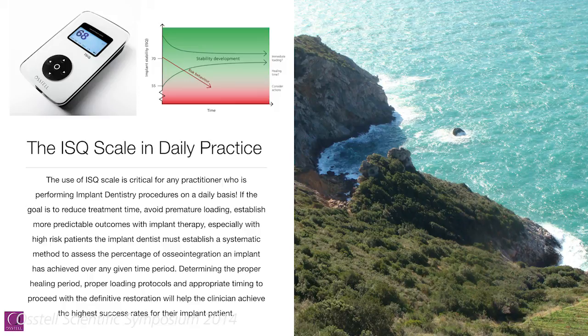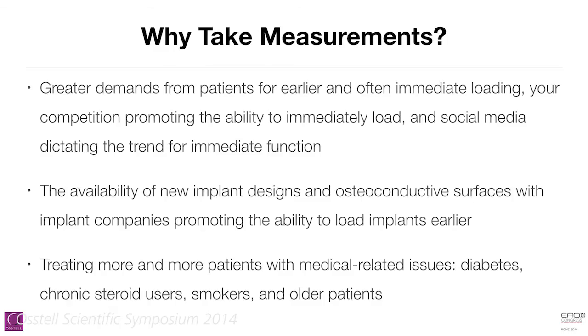And if you've ever attended any of my training courses or my advanced clinical training program at UCLA, you know that every single implant that I placed over the last 15 years has been measured with ISQ. And the reason why I take these measurements is because we are seeing more demands from our patients as far as earlier and earlier treatment times.